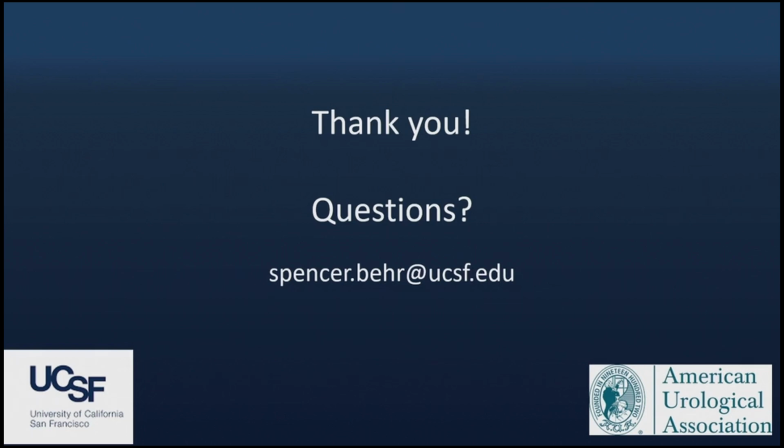Any questions online? No questions online, but maybe I'll throw two out at you. For US institutions that don't have the luxury of doing a PET MR, that have to do a PET CT instead, can we anticipate similar level of performance characteristics? I think so. As long as you have that MR, the post-contrast MR, and a good quality MR, you just have to make sure the radiologist compares them.